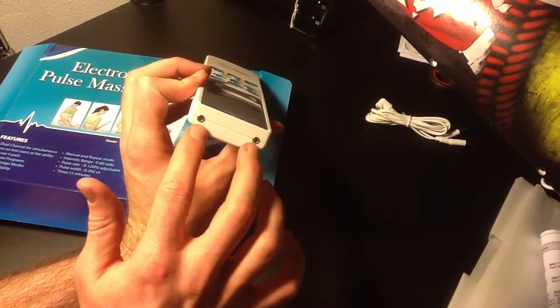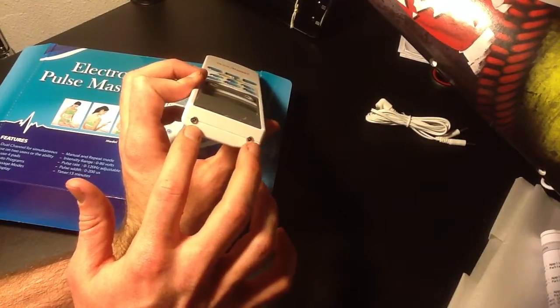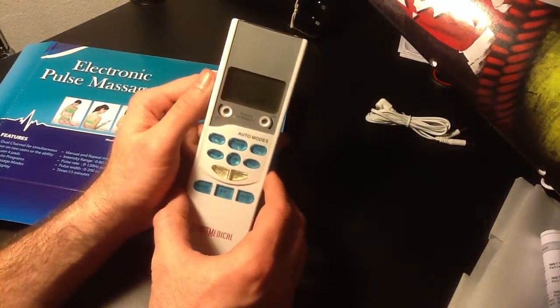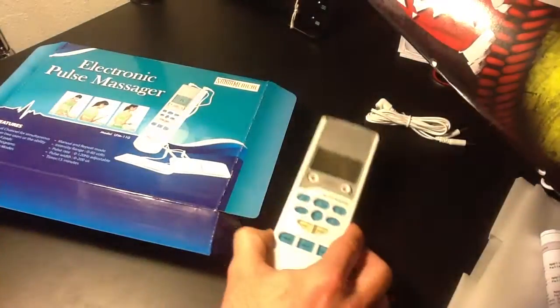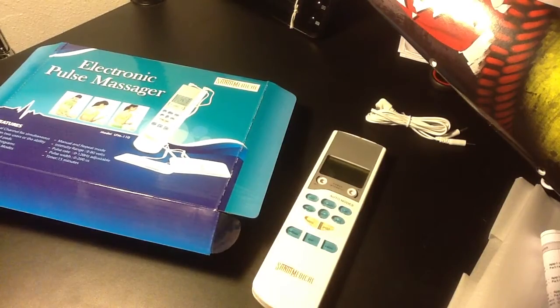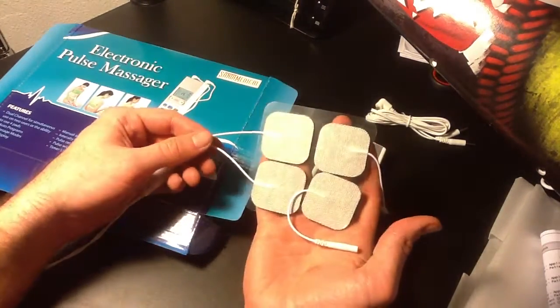On the top, we've got our two disbursement points for electricity for the different nodes. You can use one or two at a time. And what you do is you get these little pads. This comes with the unit.